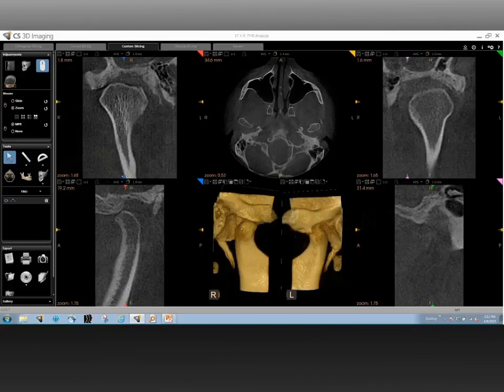That is a very common question that I get as well. So to make this very clear, the articular disc is a soft tissue structure. Soft tissue structures cannot be visualized on CBCT images. You might be able to see some contrast here and there, like we discussed in an earlier discussion. I did say that you're able to see something in the sinuses because the background is nothing but air. But in this case, that is not exactly how it is. So the articular disc cannot be visualized on CBCT imaging. If a clinician needs to see the articular disc, the best modality to go to is an MRI.